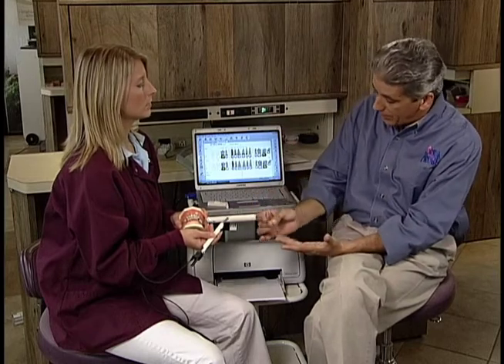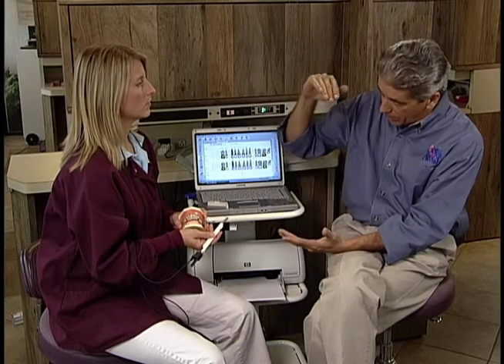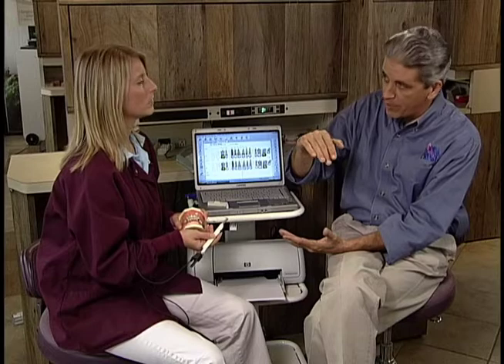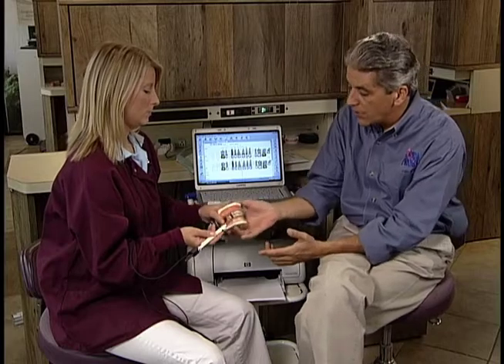Second one is finger placement. Don't put your finger on the blue button or interfere with the travel of that arm. The third one is angulation. And we've done a specific talk about that. Especially on the anteriors, we want to increase our angulation and let the tip slide down the root surface to the bottom of the pocket. If I'm too vertical, then I'm poking the patient. Sometimes we also have to change our angle of attack a little bit.